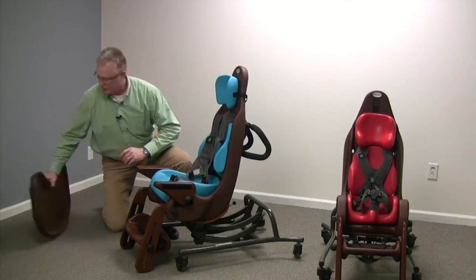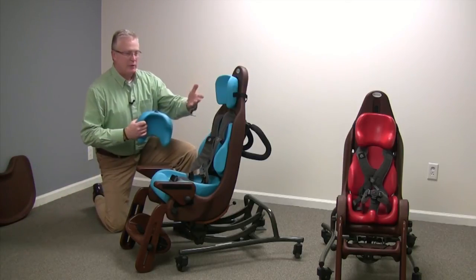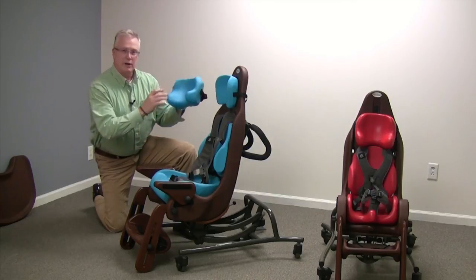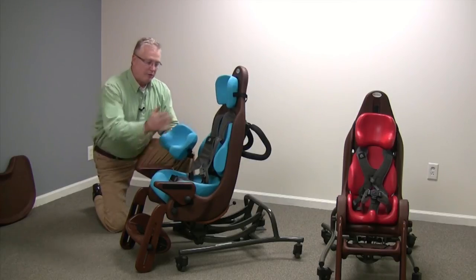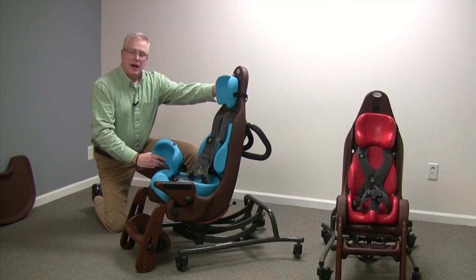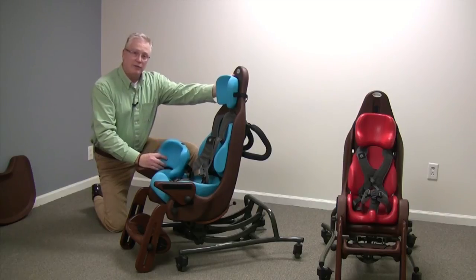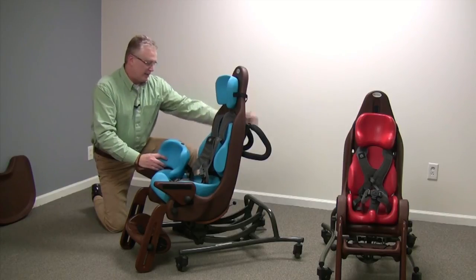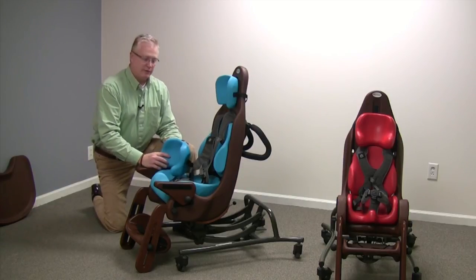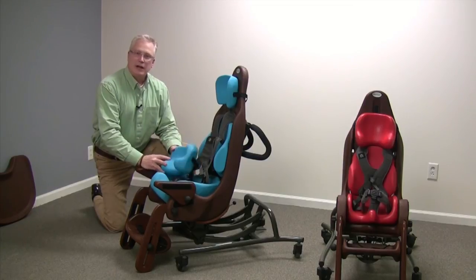Lastly, the cushion options for the headrest include a standard headrest or a headrest with laterals. All of the cushions and the shell for the High-Low MPS seating systems carry a factory five-year warranty from Special Tomato, and the base frame carries a two-year warranty. This is all from Special Tomato products made in the United States.